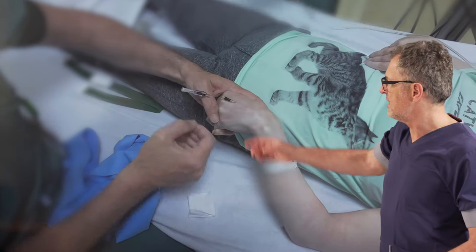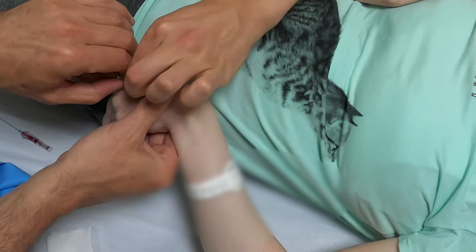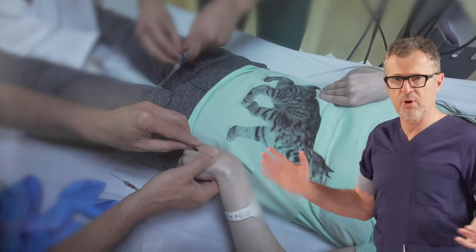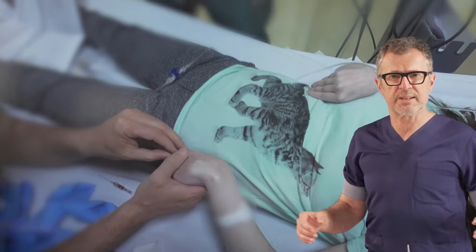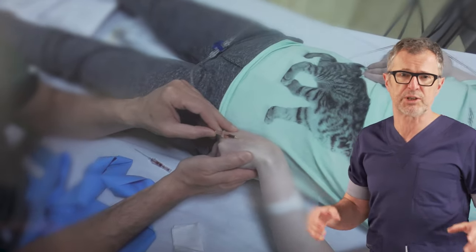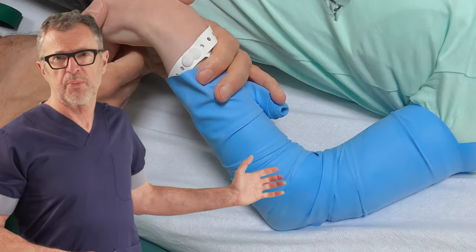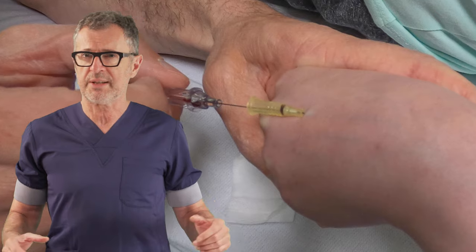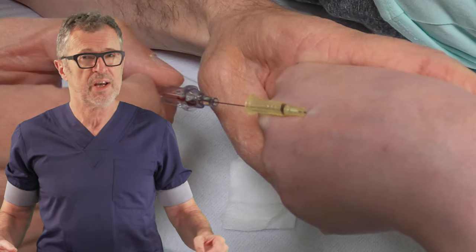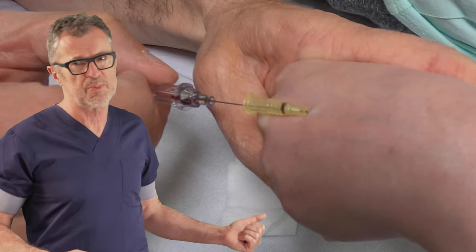Now we're going to take the needle out, compress to avoid bleeding, connect to the peripheral IV — and voila. There was IV access in a patient with cerebral palsy, in whom IV access is oftentimes next to impossible. Again, these patients are very traumatized, as are their parents, and there's a great amount of pressure every time you perform IV access in these patients.